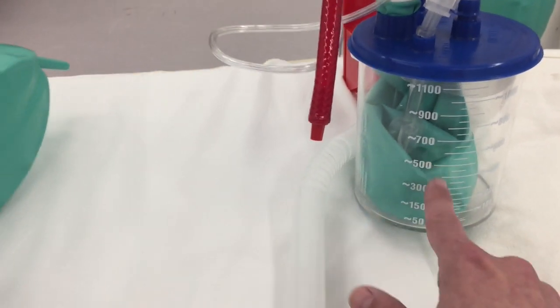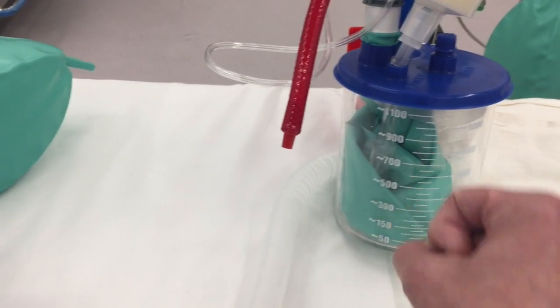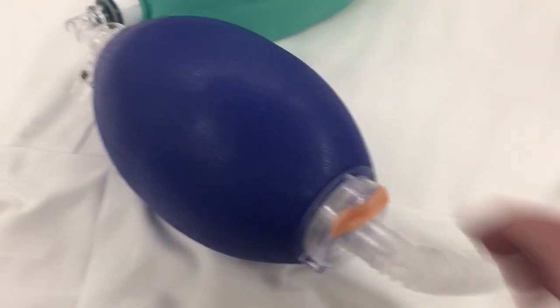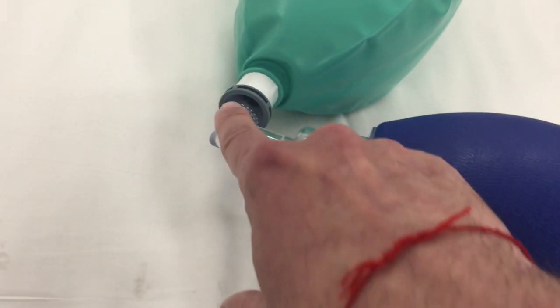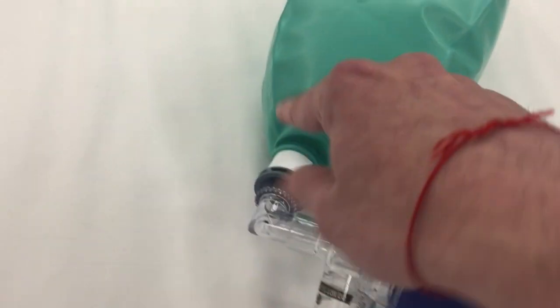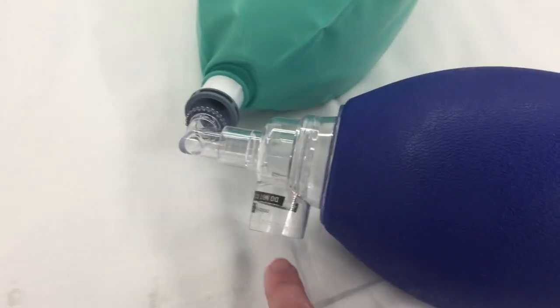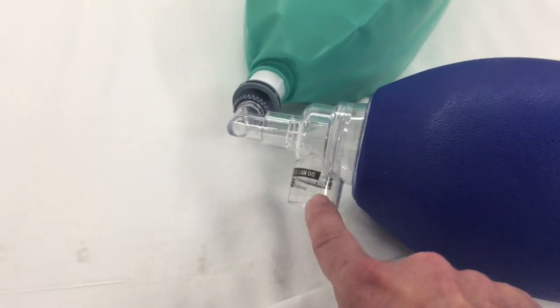This is the breathing circuit inside of it. It's basically a Mapleson B circuit with the ventilator squeezing down on the bag. And the reason we need this is that it has a built-in non-rebreathing valve that's pretty close to the patient. So this needs to be sitting very close to the patient, and they exhale through here — and you can easily set up a PEEP and a HEPA filter through there.